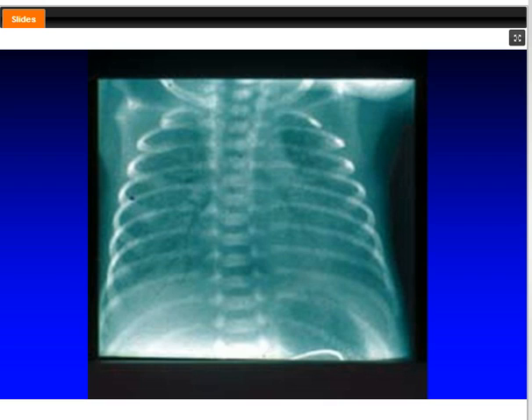Some of these babies may need mean airway pressures of 30, 35, and in fact, this very baby that I treated in San Antonio needed a mean airway pressure of 40 to get the lung open.